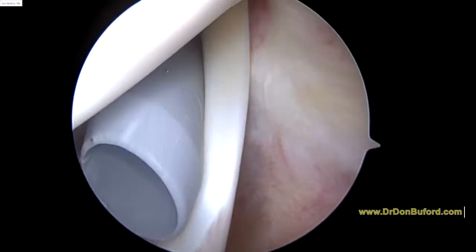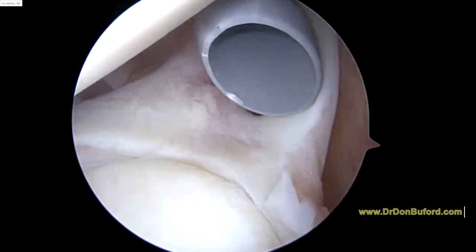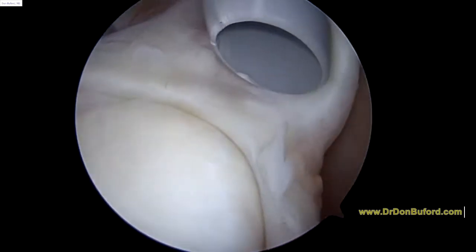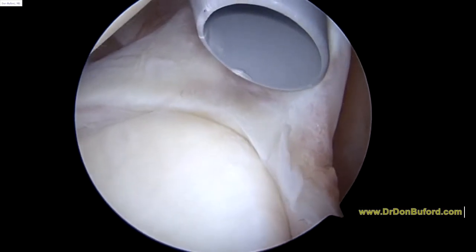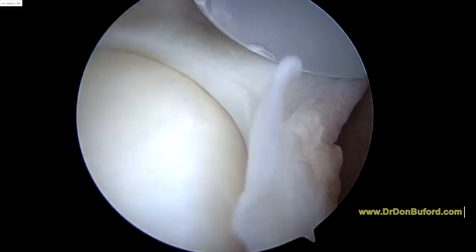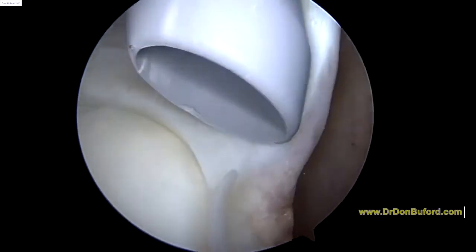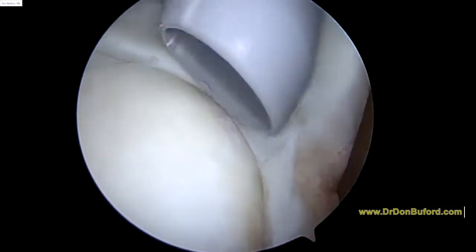To the right of that is the long head of the biceps tendon. And we can see that inserts down into the labrum here. As we tug on it, it pulls away a little bit, but this is not a SLAP lesion. This is a normal amount of play. There's some other things that we look for arthroscopically to make sure, and we don't see any cracking in the cartilage here. See how the cartilage looks normal? No signs of any problem. The inner edge of this labrum looks normal, right in front of the biceps anchor. So I would say this is not a SLAP lesion and does not require repair.